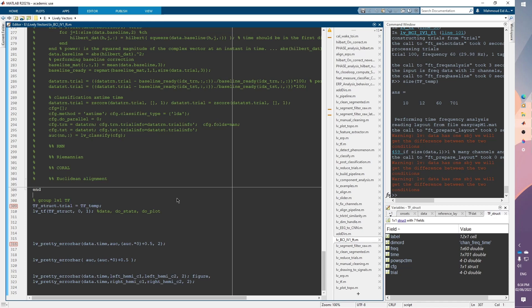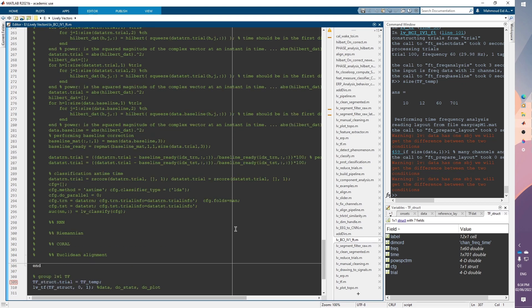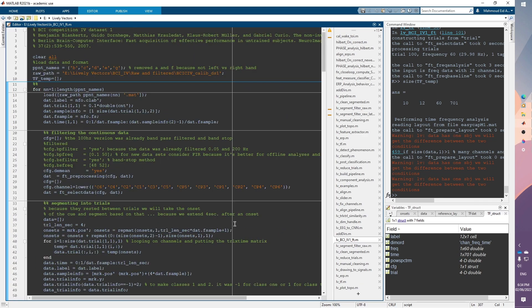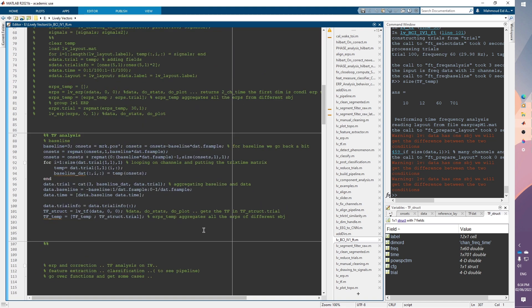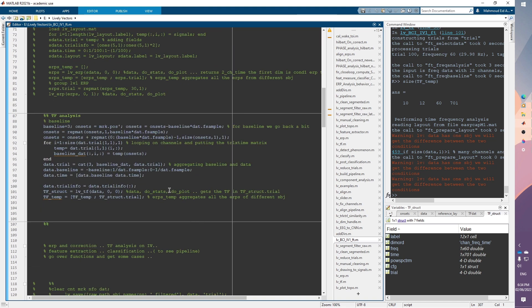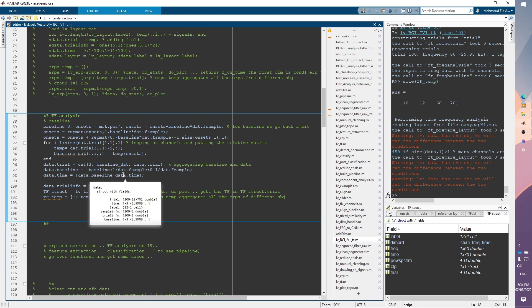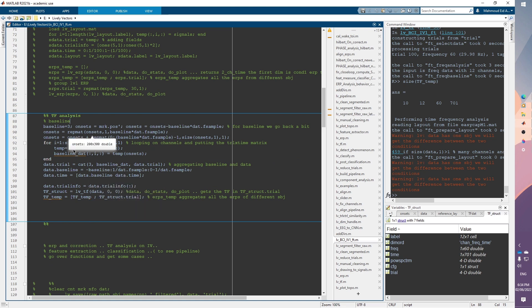Welcome to this episode where we'll talk about inter-trial phase consistency or coherence, and see how we can apply this on our data — or any other datasets — in the same manner that we use time-frequency analysis. To apply inter-trial phase consistency, I'm building on the last video, so please check the time-frequency analysis video first.